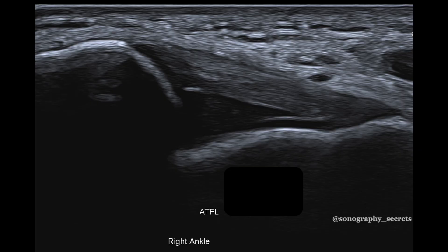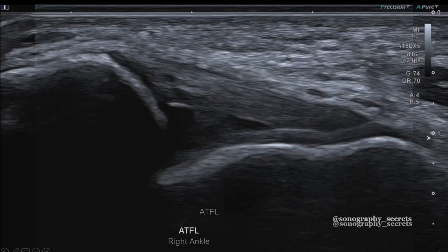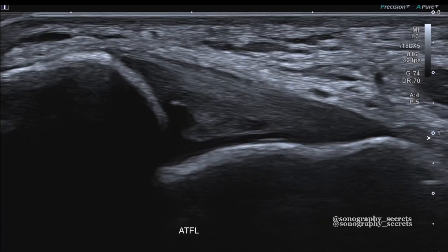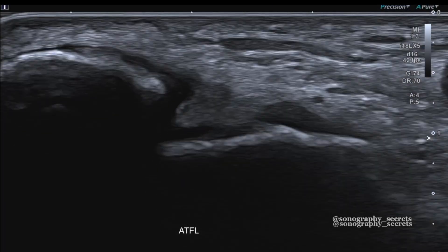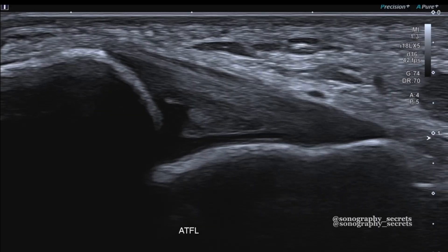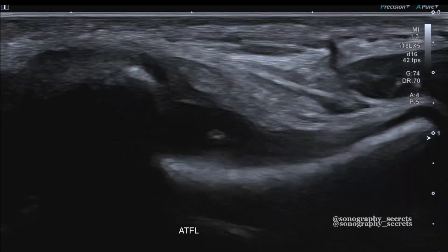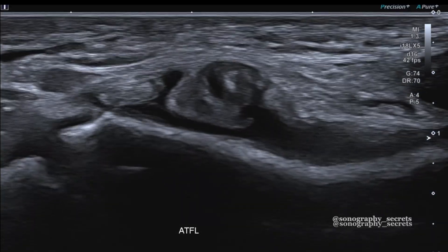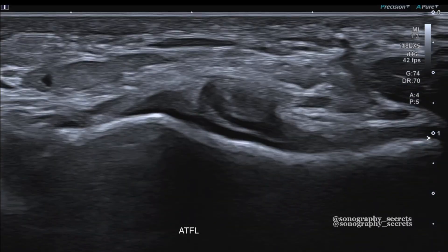Here is a normal ATFL. This is the fibula and this is the talus. The fluid deep to the ATFL is normal, as it is a capsular ligament. It's also normal to see a small amount of fat within the joint — seen here as this echogenic material deep to the ligament.